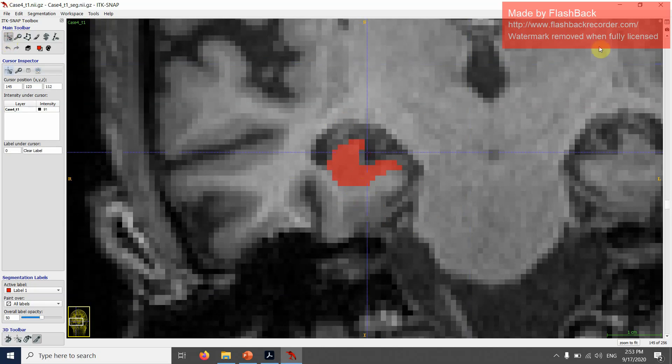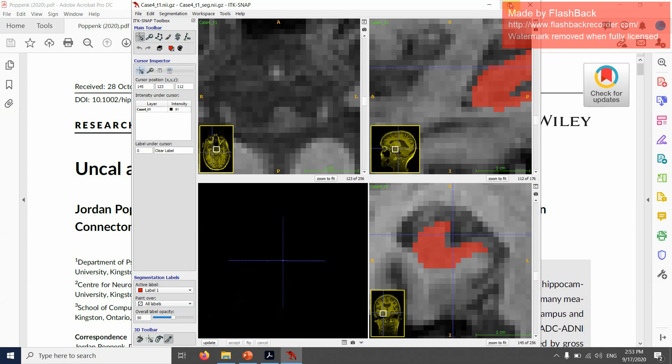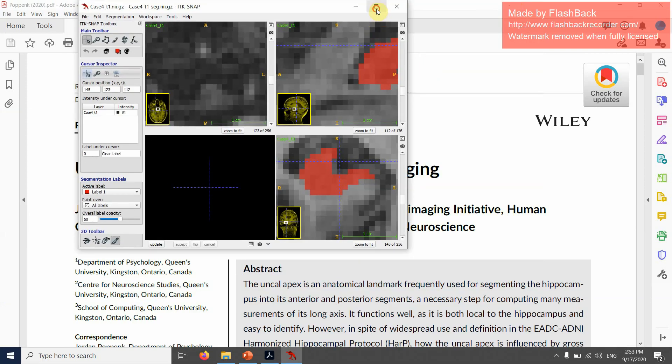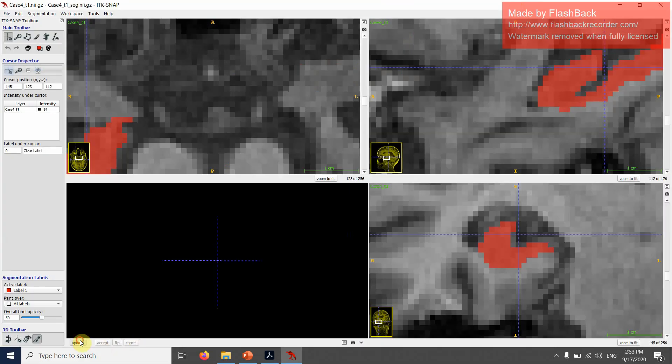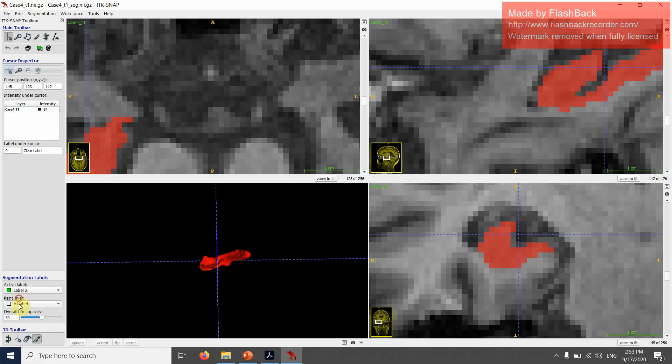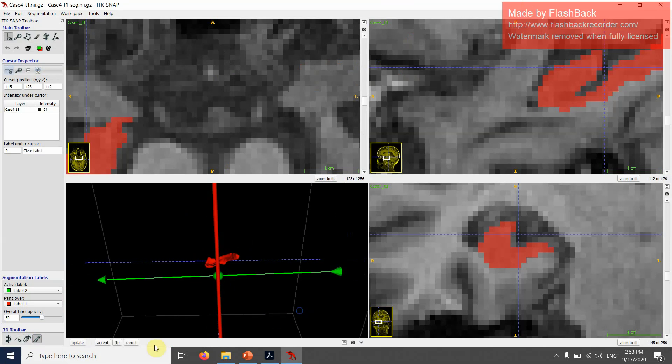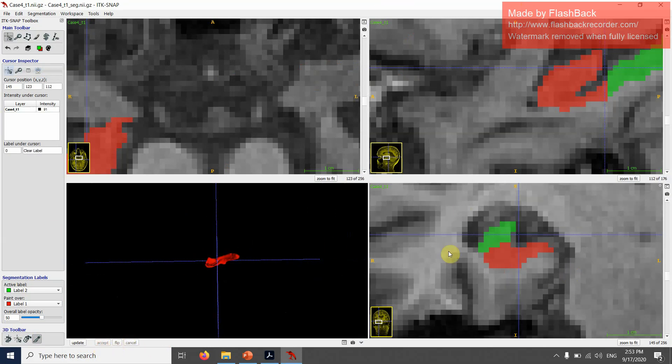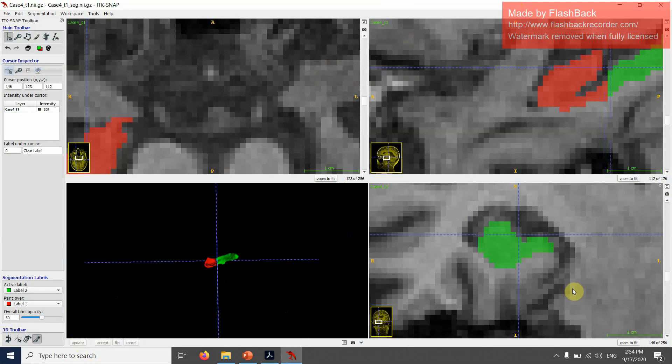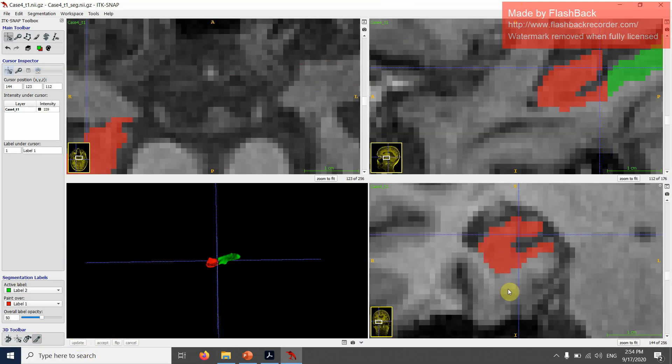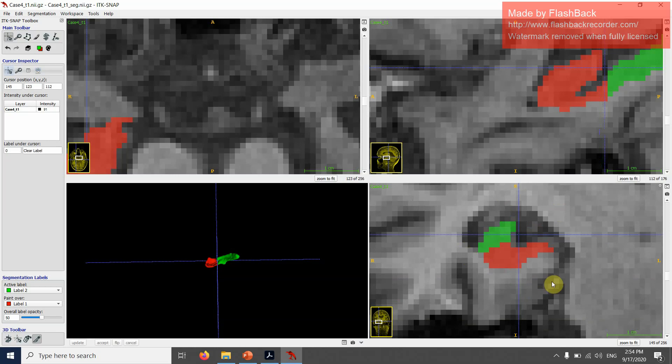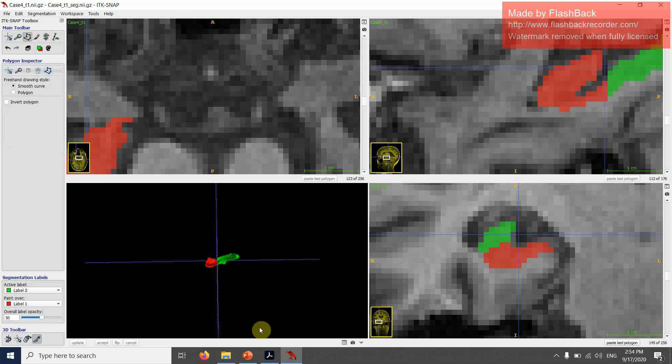I'm going to do the labeling again. Sometimes this happens in the coronal plane. This was the last slice and this should actually be green. I'm going to fix this. In the 3D plane that doesn't always work perfectly, so be sure to check in your coronal plane and fix it.